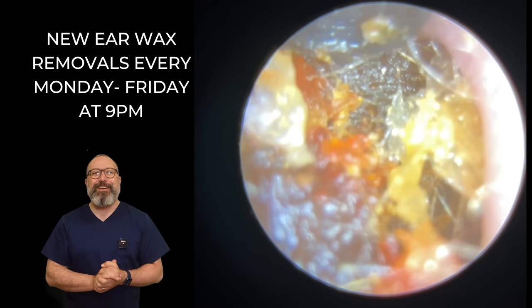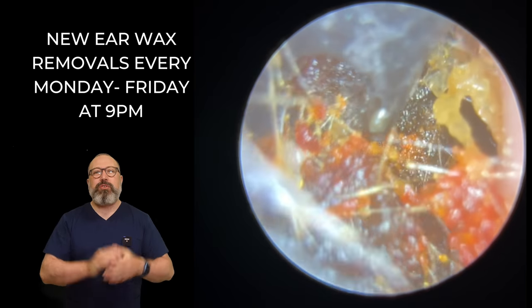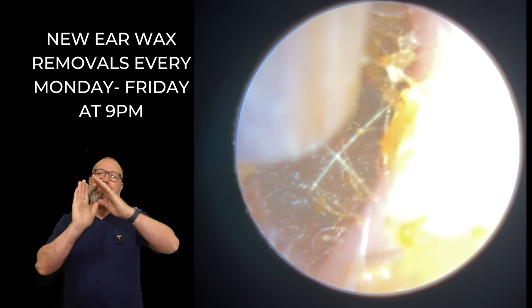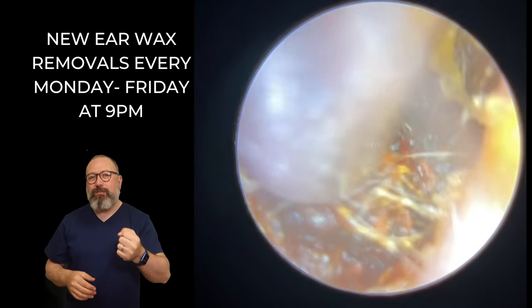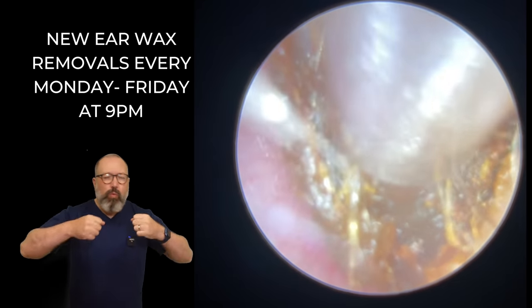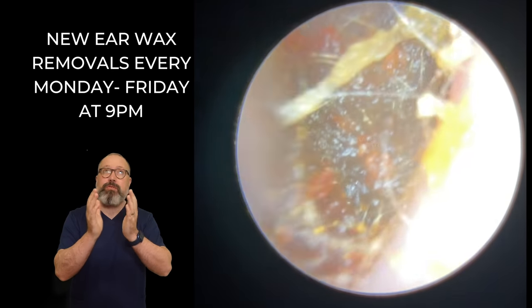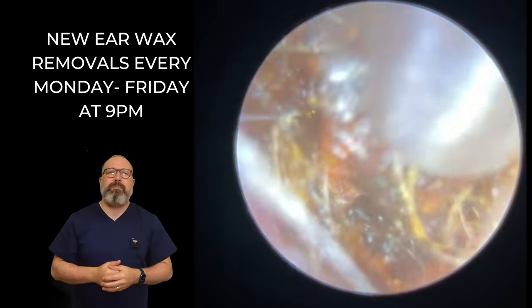But you can see here it's come away nicely. We've got this basically nice plug here. Just trying to use the Jobson horn — you can see what's happening here. What I'm trying to do with the Jobson horn is get above the wax, but as I'm trying to push above it, it's just folding the wax backwards. So I've got to try and pull this forwards. Sometimes what we can do is bring the plug forwards and wedge it right in between the entrance to the canal, between the canal walls at the entrance.